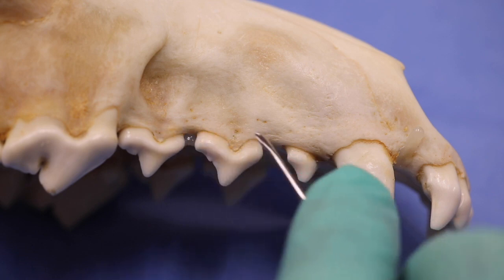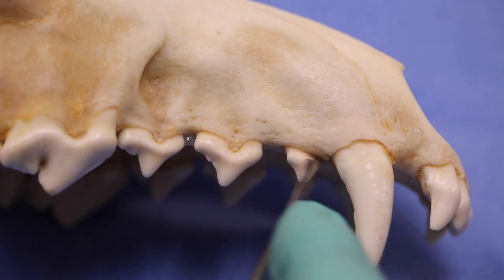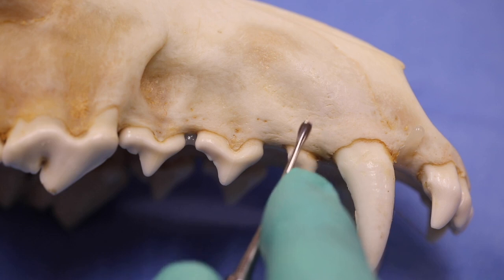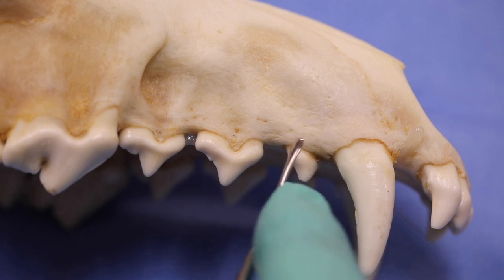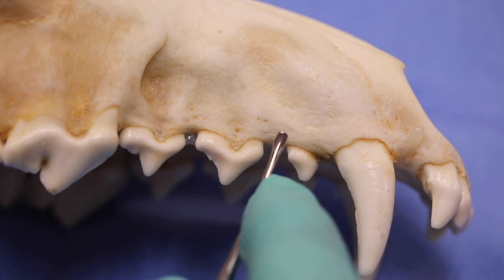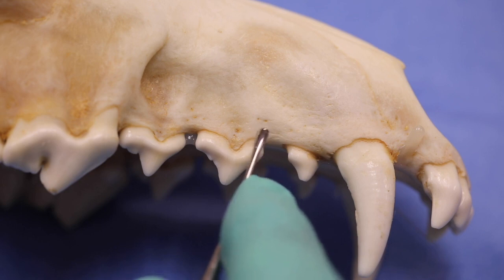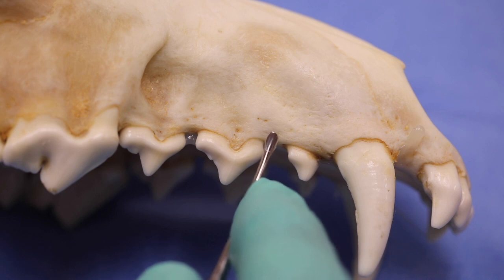around. And again, you want to go the entire periphery of that for 1 to 2 millimeters, and then that 15-degree angle. And one of the most important things is we're not going like this. We're actually lifting that up with a torque with our fingers. So we place it, we move our fingers so that it rotates that elevator and moves that tissue off without putting forward pressure on, but mainly putting pressure downward onto the bone.